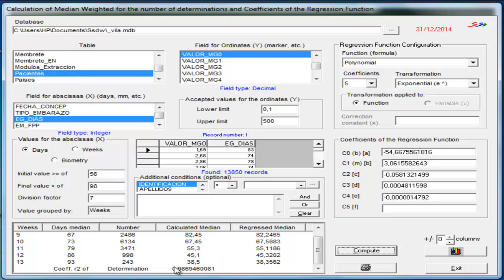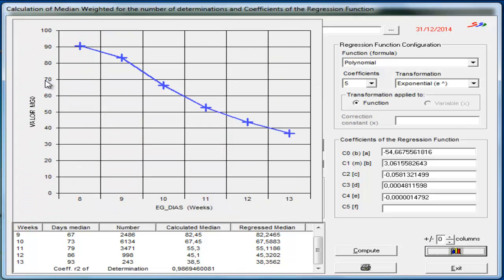When we look at the graph, surely this would fit the curve of chorionic gonadotropin better than the previous one. If we had samples of week 7, we would observe that the value of chorionic gonadotropin increases, as well as at week 8. And in the following weeks the value of chorionic gonadotropin descends, so a 4th degree exponential equation could be used as the equation of the medians for chorionic gonadotropin.